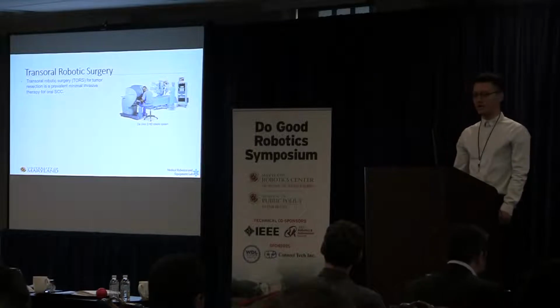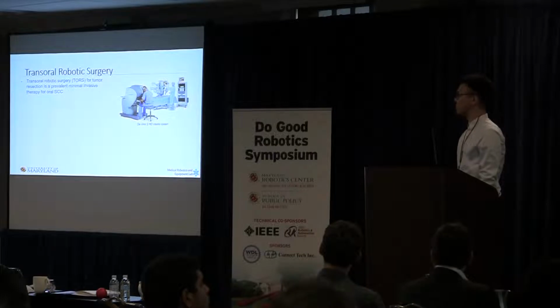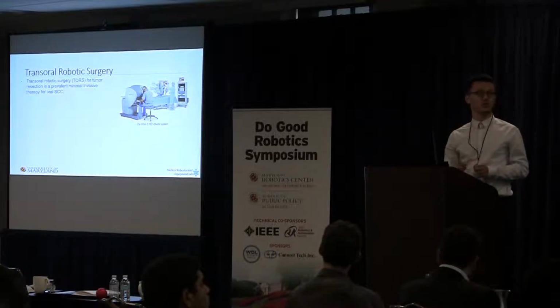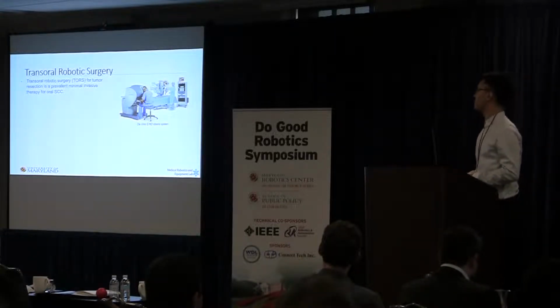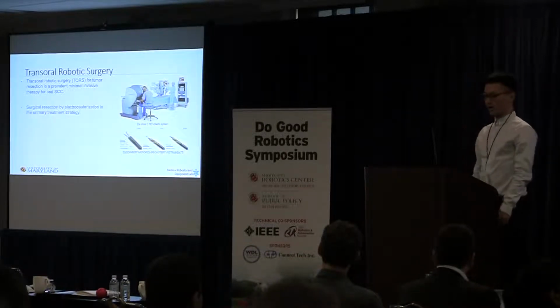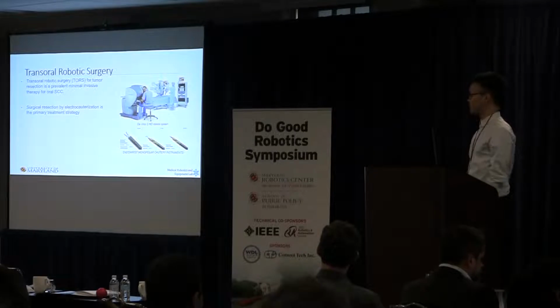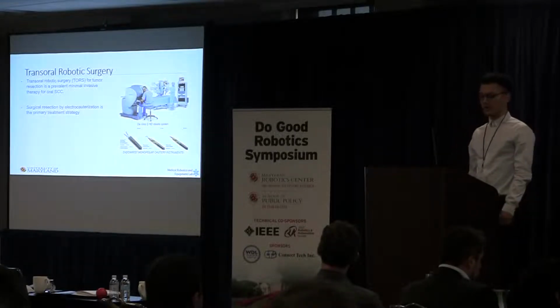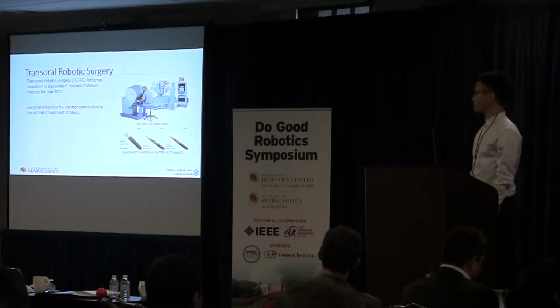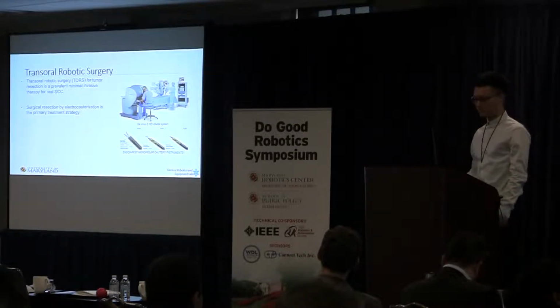As you can see from the image, it's a Da Vinci robotic system. The surgeon sits in front of the surgeon's console, controlling the two robotic arms under the vision scope, and all his motion will be replicated and transferred to the patient side, and the robot will operate directly on the patient. I want to let you know this surgical resection is not done by a regular surgical knife. It's done by electrocauterization. That's the primary treatment strategy today. The electrocautery tool can look like a scissor, a hook, or a spatula.